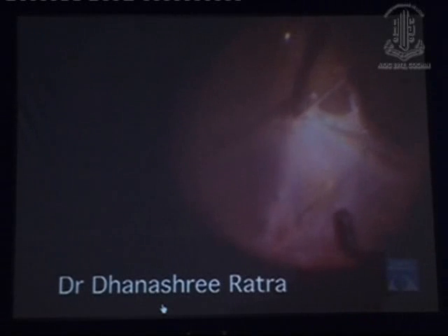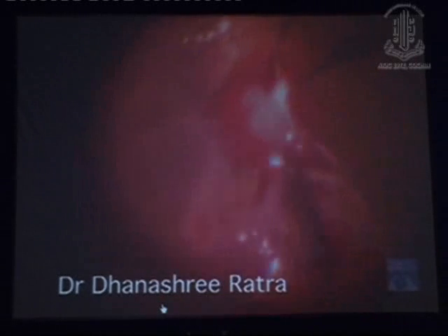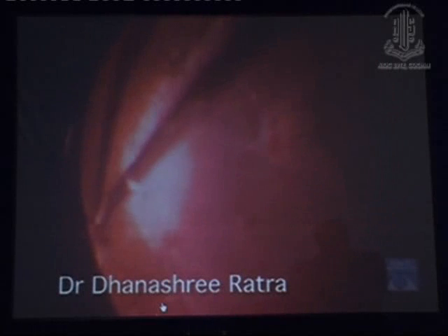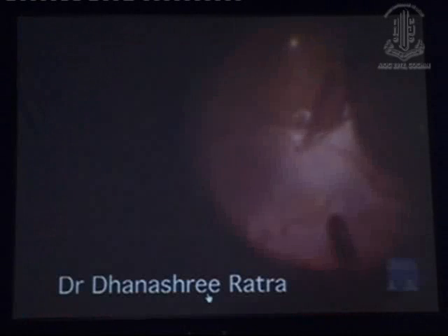Coming to the final video, what you are seeing here is that extensive membrane dissection can be really risky, because under oil, if there is a lot of bleeding, it sometimes becomes very messy to go ahead with the surgery. One important pearl that I want to mention is that scissors rather than cutters are preferable to cut bands of membranes in under oil situations.